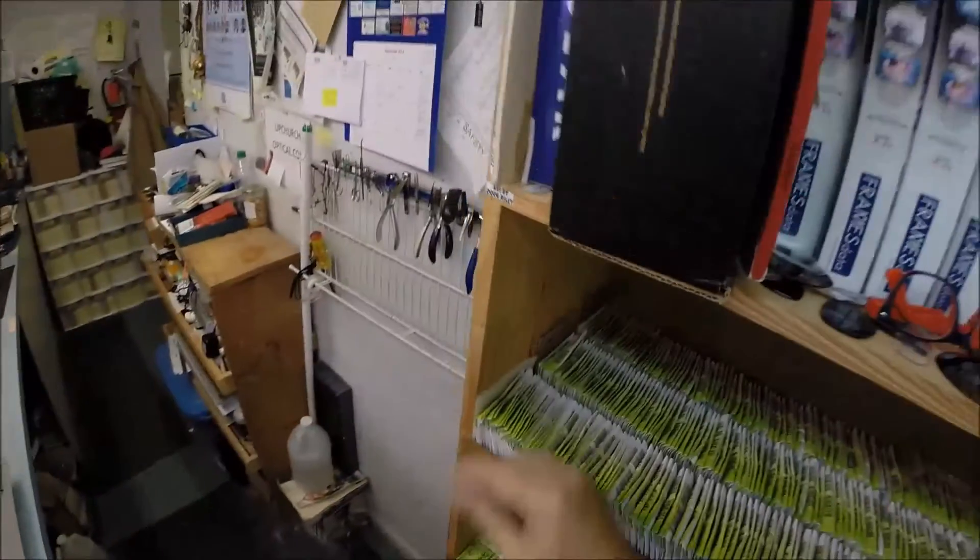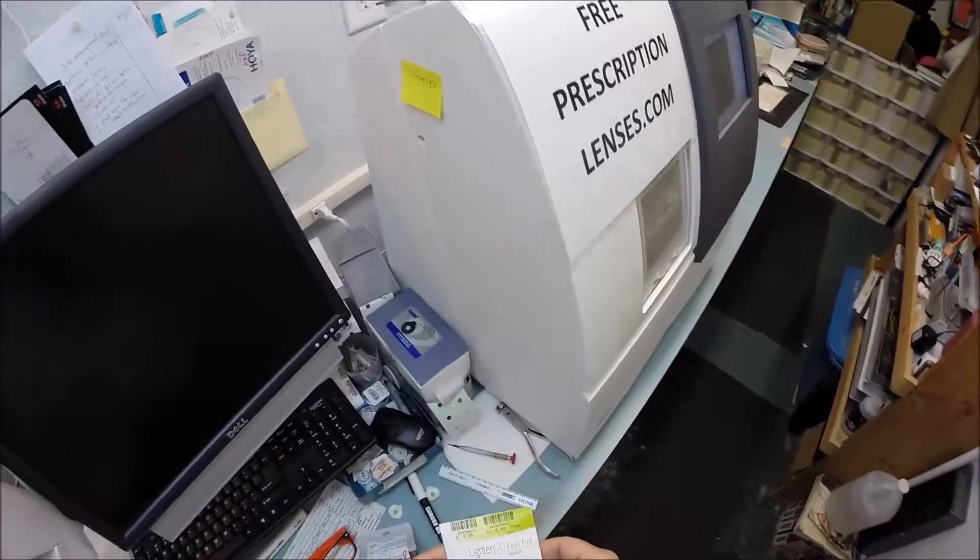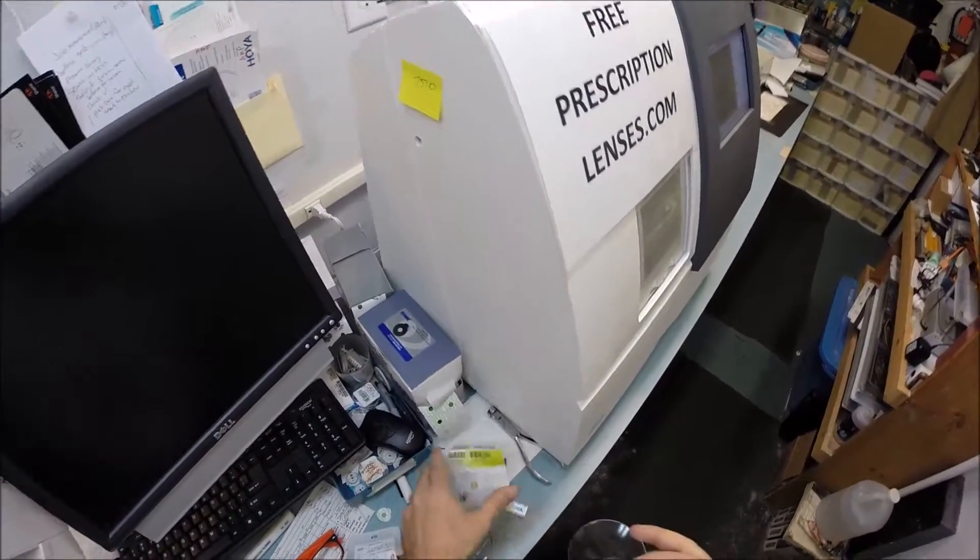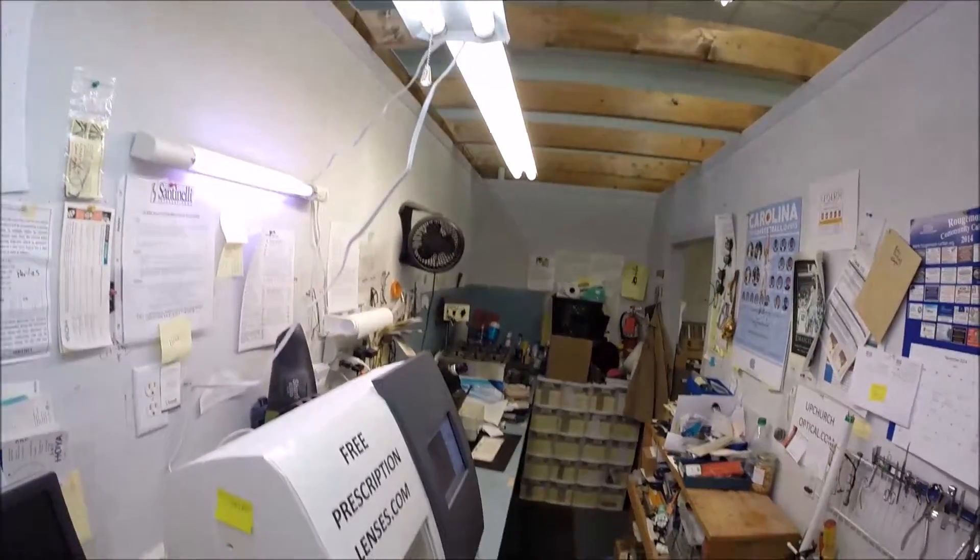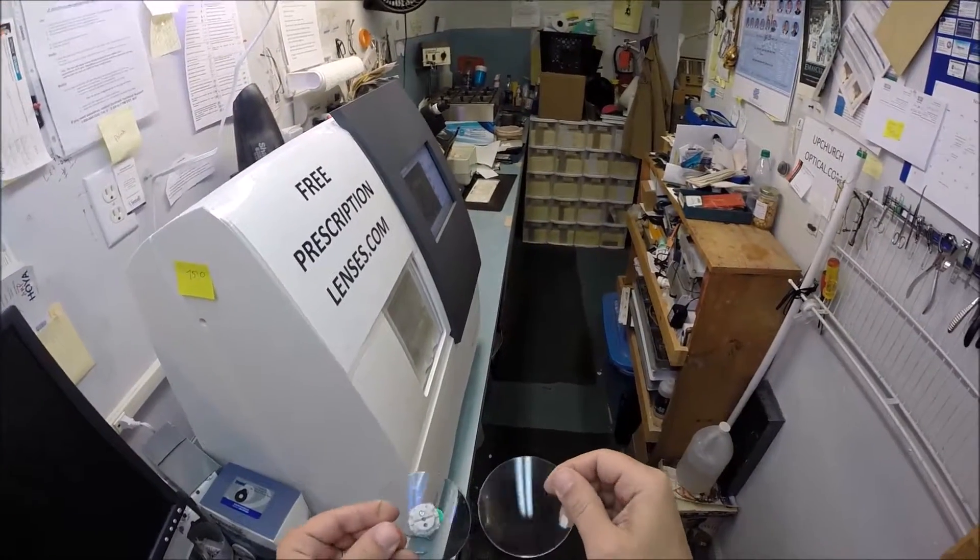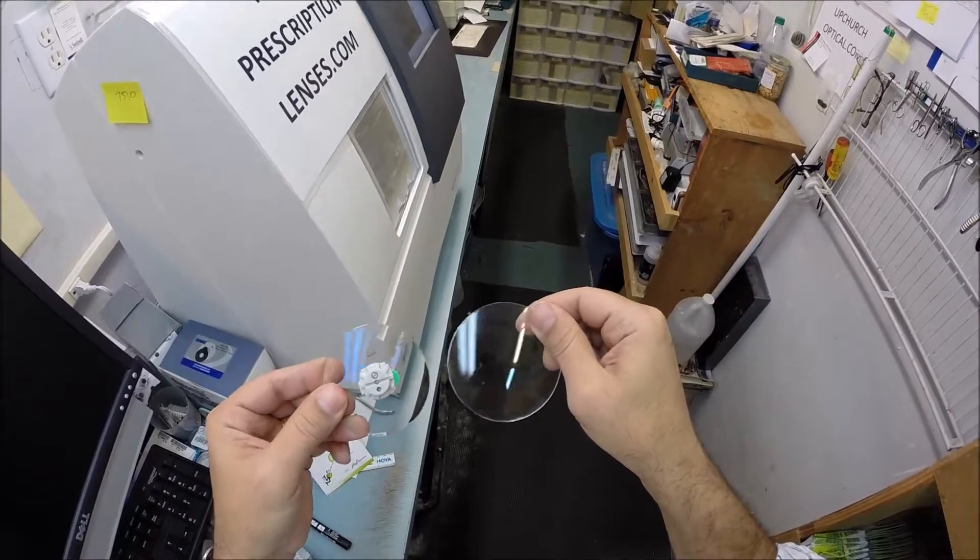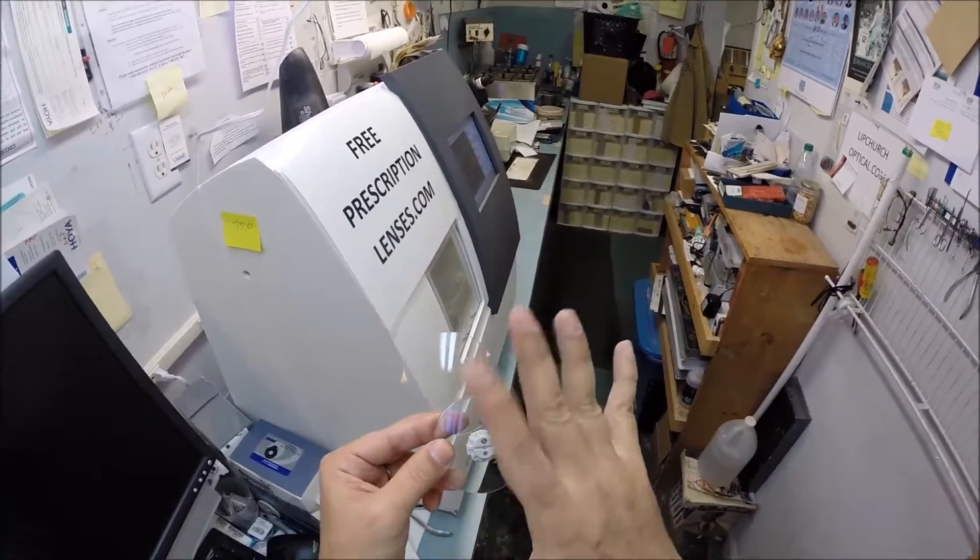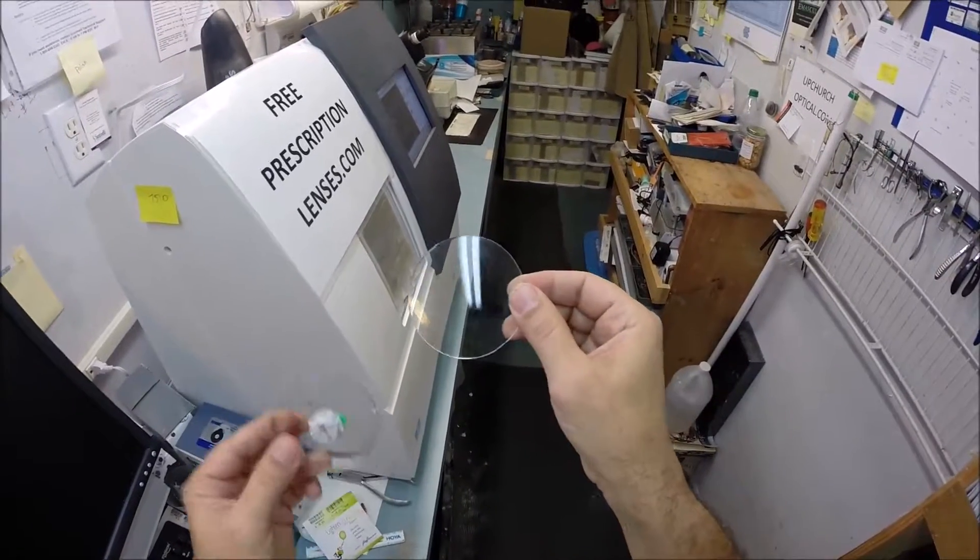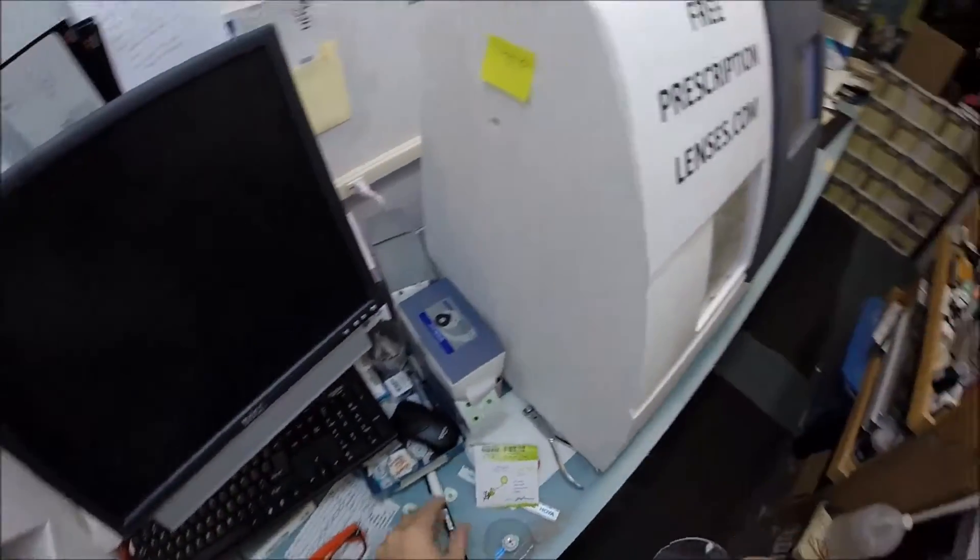These lenses are the Transition 7 gray lenses with the Crizal Alize anti-glare coating. I'll show you what the transition does at the end. Anti-glare is actually three features in one. The first feature is that it eliminates glare while driving at night, particularly in the rain, but from streetlights, stoplights, computer screens, overhead fluorescent lights. The second feature is it's an anti-reflection lens, so when someone's looking at you, they're not looking at their reflection in your glasses.